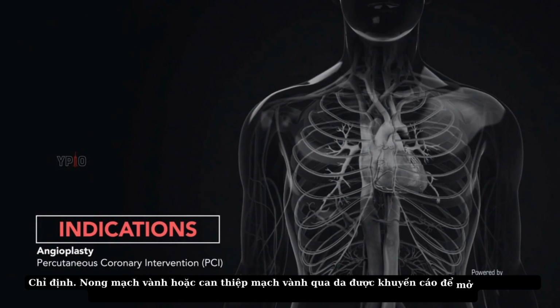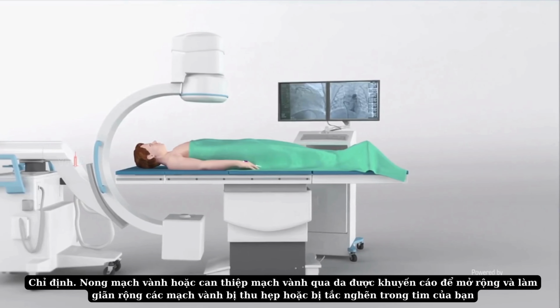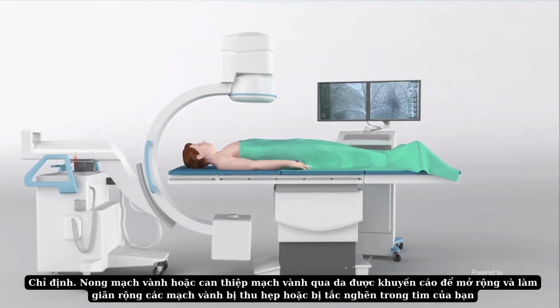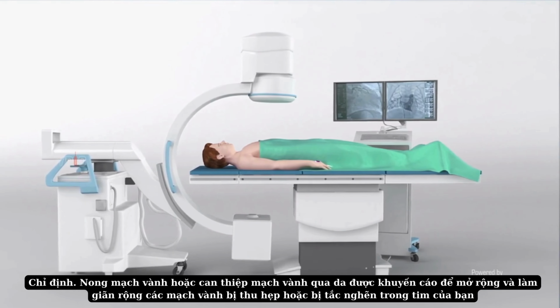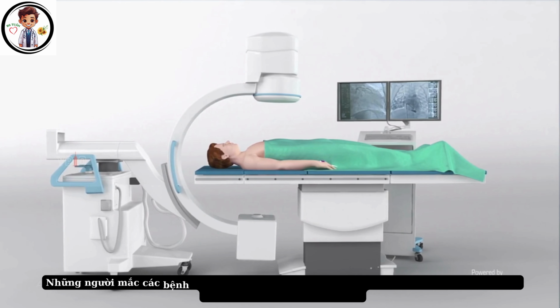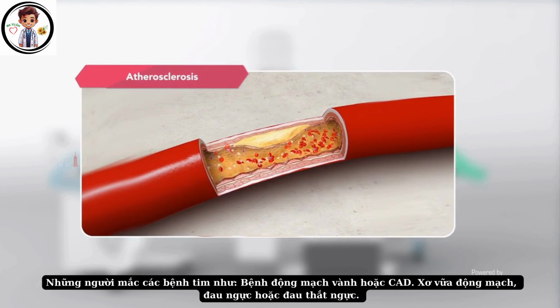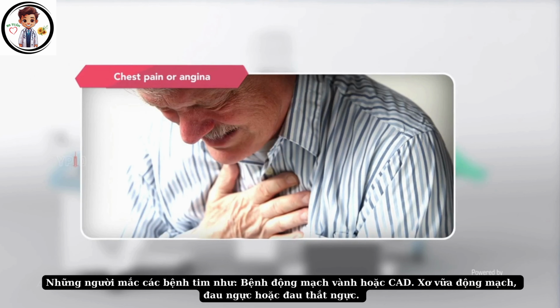Indications: Angioplasty or percutaneous coronary intervention is recommended for opening up and expanding the narrowed or blocked coronary arteries in your heart. Suitable candidates are people with heart diseases such as coronary artery disease or CAD, atherosclerosis, chest pain or angina.